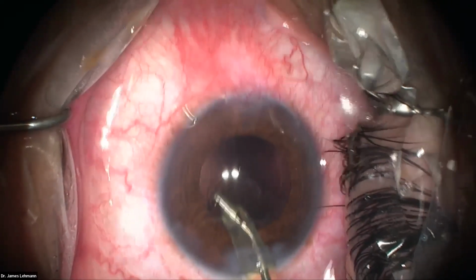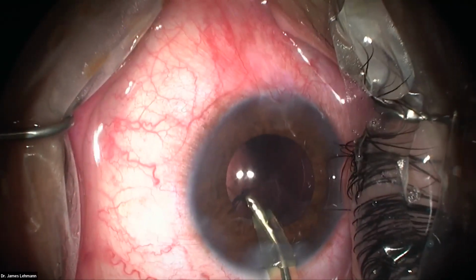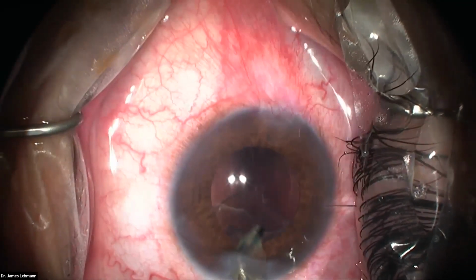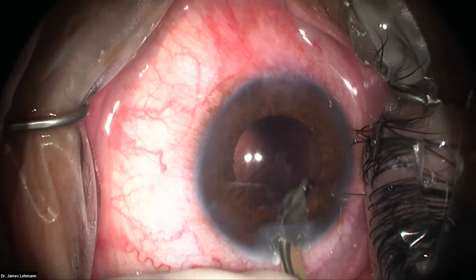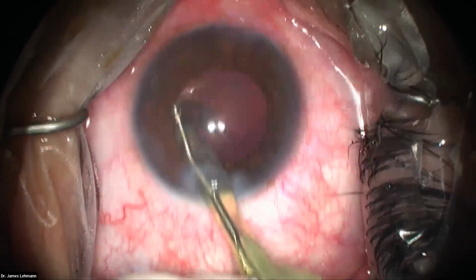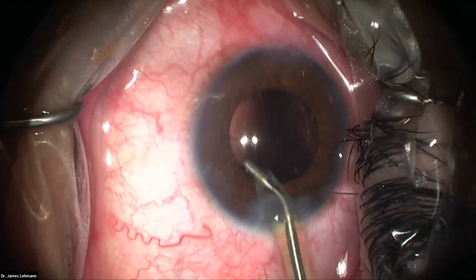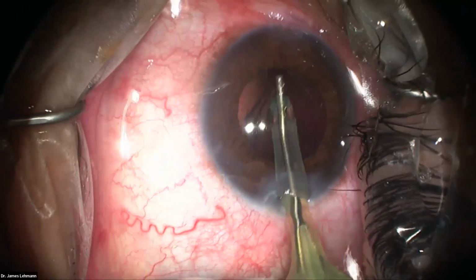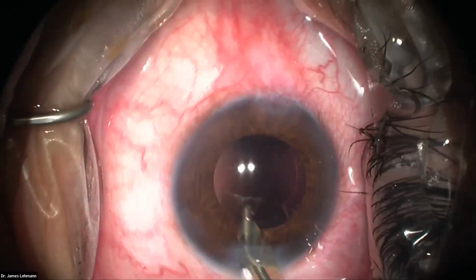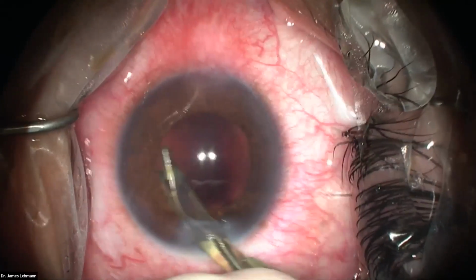No, this is fantastic. One of the questions that people were asking about were any tips or tricks you have for soft nuclei where you go in and it just is like mashed potatoes and you're trying to get a soft but intumescent lens out. Do you have any tips or tricks there? I like to hydrodissect those and just flip them out of the capsule completely, because you can't really fracture them. You can't really do divide and conquer on those very easily. So I like to do pretty aggressive hydrodissection. And since they're so soft, they kind of prolapse themselves out of the capsule into the anterior chamber, and then you can eat them. So I got all that cortex, and now I'm just getting some little remnants here.